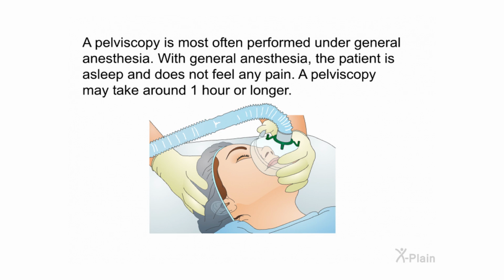Pelviscopy. A pelviscopy is most often performed under general anesthesia. With general anesthesia, the patient is asleep and does not feel any pain. A pelviscopy may take around 1 hour or longer.